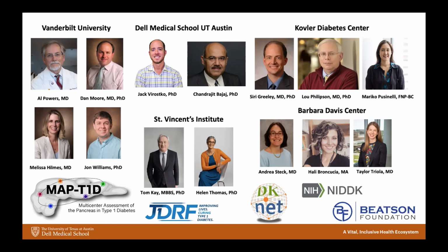Most people who are buying an MRI machine are doing it because they want to get a pretty picture, right? So often those benchmarks for the MRI systems will be a kind of phantom that has a spatial grid, so you can pick out the spatial resolution of the image, and you can get those sorts of measurements. In terms of the more research-oriented stuff, like quantifying diffusion-weighted MRI and making quantitative T1, T2 maps, typically the vendors are not into that as much. I think there's a movement to make imaging, and MR particularly, more quantitative, but most of those phantoms that I talked about aren't made by the vendors.